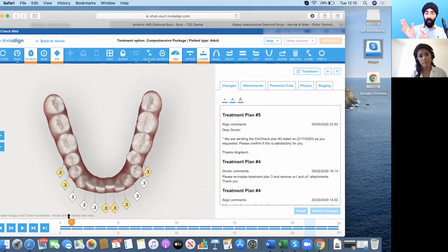So in that case, I'd be more inclined to get my soft flex disc out and actually disc the mesial surface. Is there a better way to do it than that? Is there a different way? Yeah, so alternatively, you could use a really fine non-cutting burr. And I will only use burrs posteriorly. Anteriorly, I'll just use the strips because I have more control. I can protect my soft tissues with cotton wool rolls. You can also use suction to protect your soft tissues. But posteriorly, if I need to take a significant amount away, I'll use the burr.